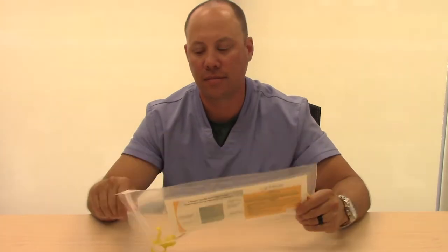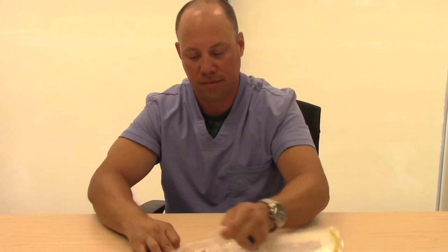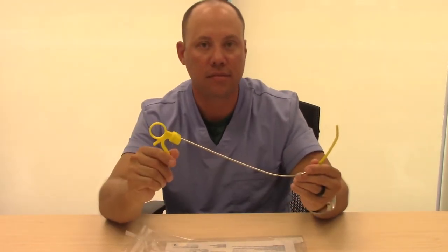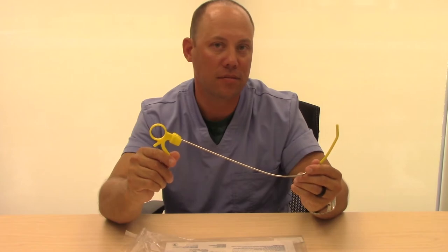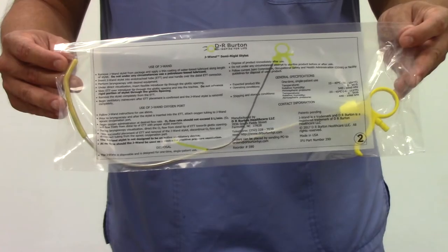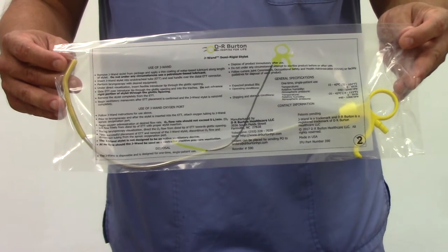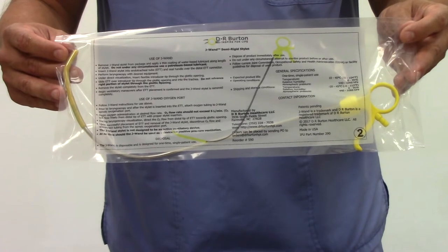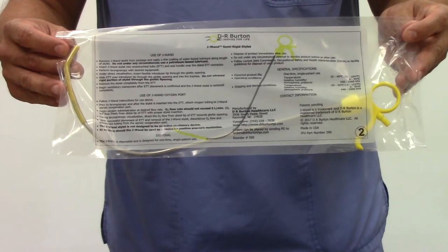The J-WAND is an intubating stylet that helps give support within an endotracheal tube during the intubating process. It can be used with traditional or video laryngoscopy equipment. The J-WAND is a sterilely packaged, non-latex item and a single-use device that is disposable.